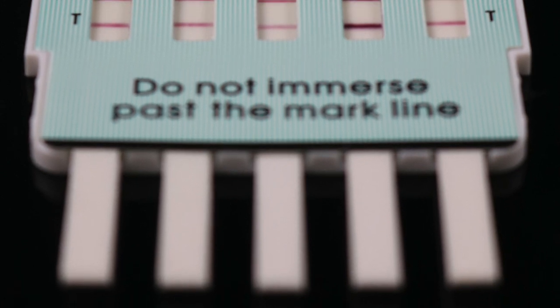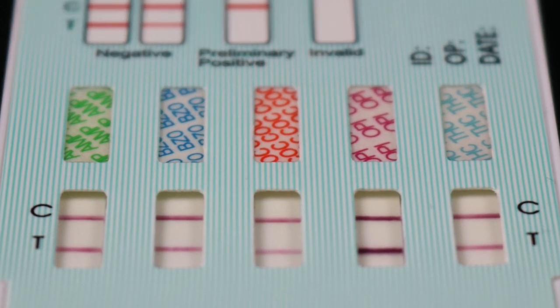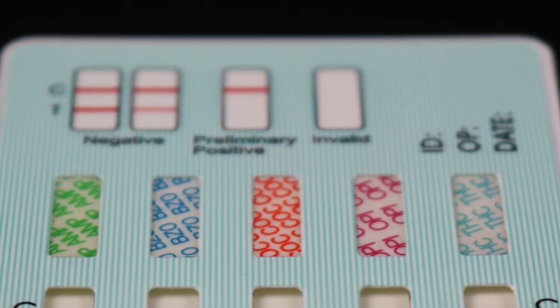Customers choose Easy at Home because of its outstanding quality, solid and clear results, quick and accurate performance, and access to professional service.